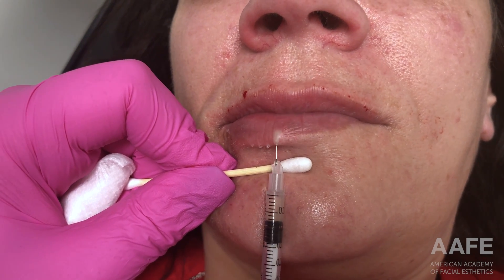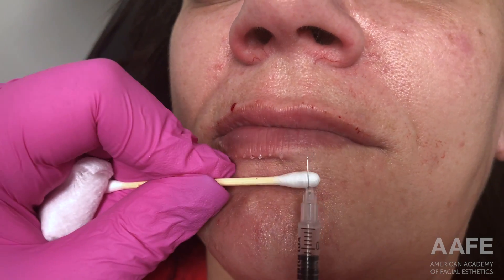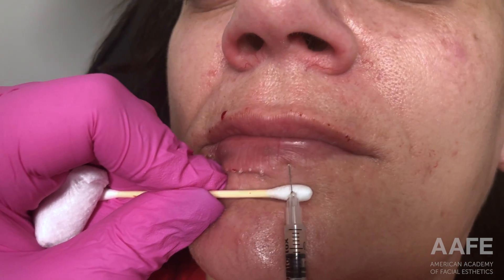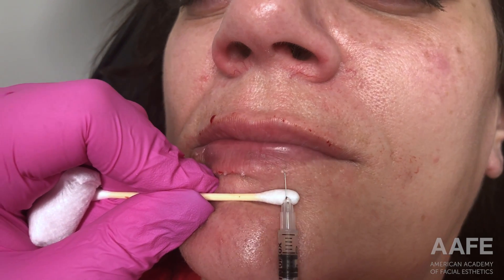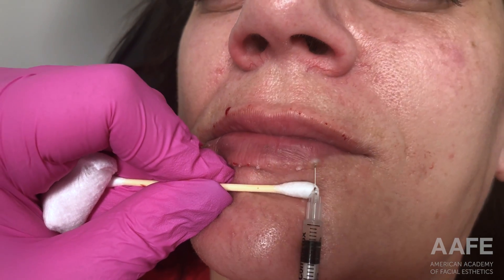Most patients enjoy more lip show over projection because it tends to be a little more natural appearing. That's why on this patient I'm also utilizing the AFE right-angle technique all across the bottom lip as well, to really help pull down the lip, give more of a pouty appearance, and add more shape and height to that lip.